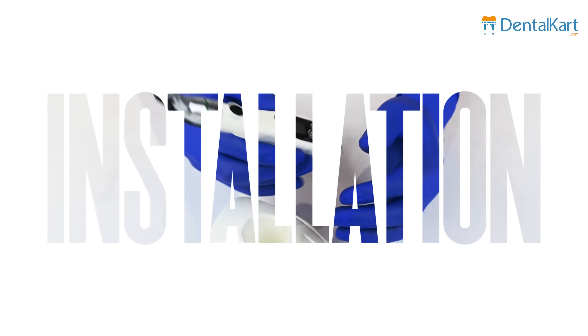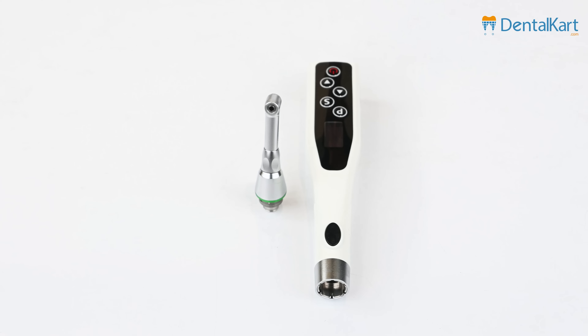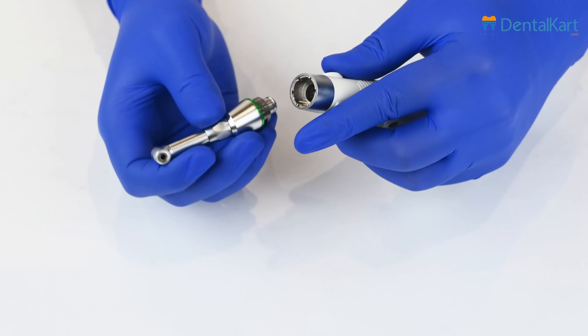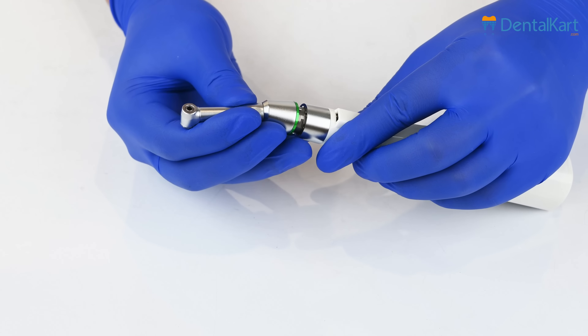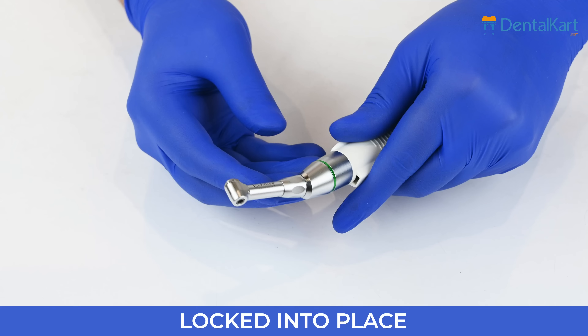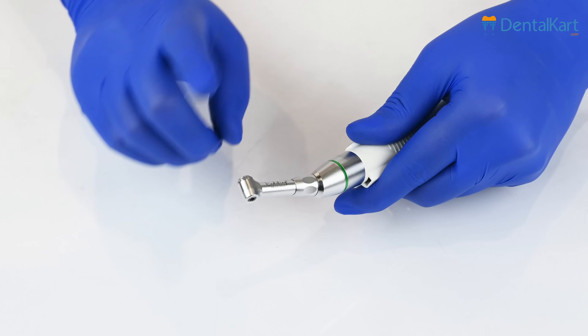Let's walk through the installation process of the Endoking Cordless LED Endomotor. Begin by ensuring that the endomotor body is powered off. Then align the pins on the handpiece with the corresponding socket on the endomotor body. Apply gentle pressure — you will hear a click sound, ensuring it is securely locked in place. Remember, you cannot rotate the handpiece while it is attached to the endomotor body.